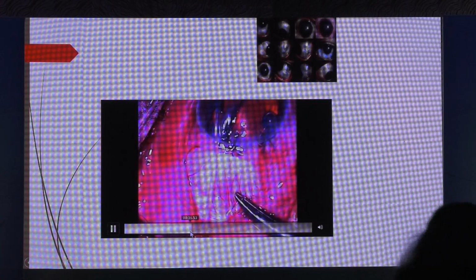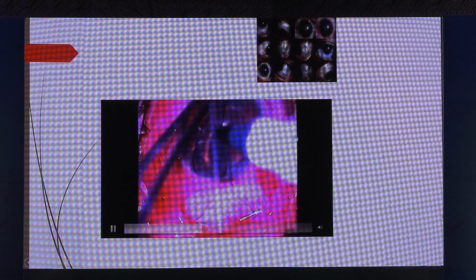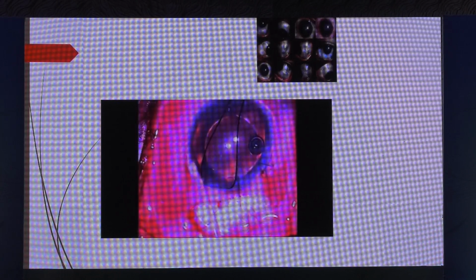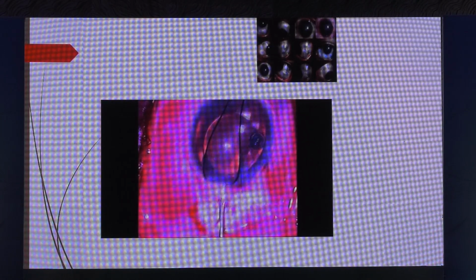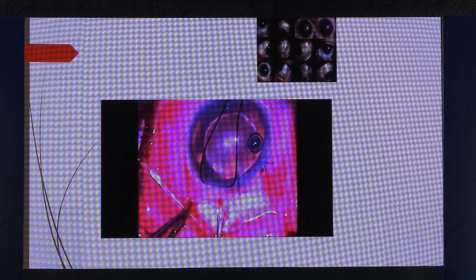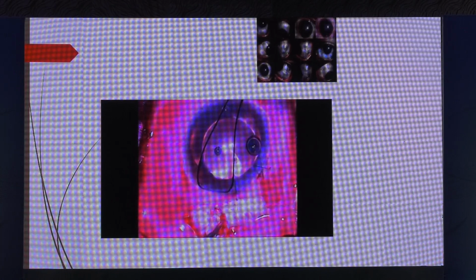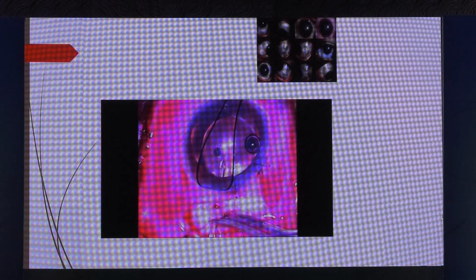This patient had 270-degree anterior ciliary staphyloma. Only the nasal quadrant was free of staphyloma. So you have to choose a quadrant which has minimal scarring and which is free of any comorbidity. And the advantage of combining it with phaco is that you can put the tube in the sulcus if you have a slightly dilated pupil preoperatively. If the pupil is small, then you have to be very, very careful that the length of the tube is large enough that it doesn't get obstructed by the iris post-operatively.